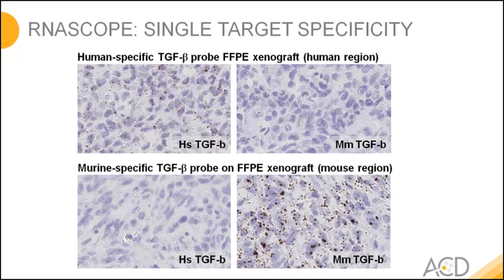So that is the typical threshold. If you have less than 85% homology, the assay will discriminate. Once the homology gets to 95% or above, like between human and monkey, for example, then the assay gives you the full signal. The assay also ignores point mutations. And then there you have a gray zone between 85 and 95% homology. This is a homology region that we avoid. So we try to come up either with less than 85%, and you clearly know, yes, this will discriminate, or we design in a way that the homology is 95% or better, then you know you get the full signal. So these are the guiding principles for our design team.